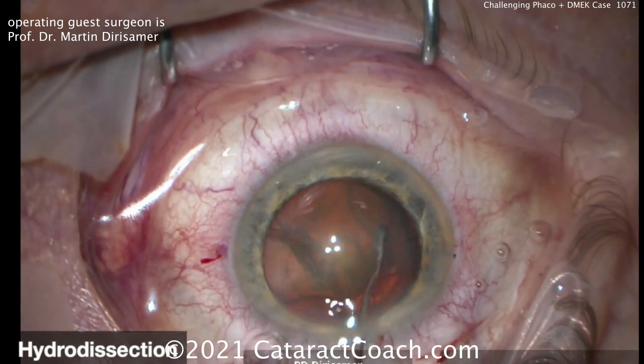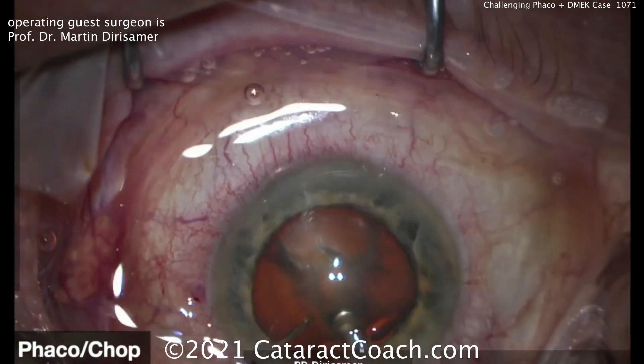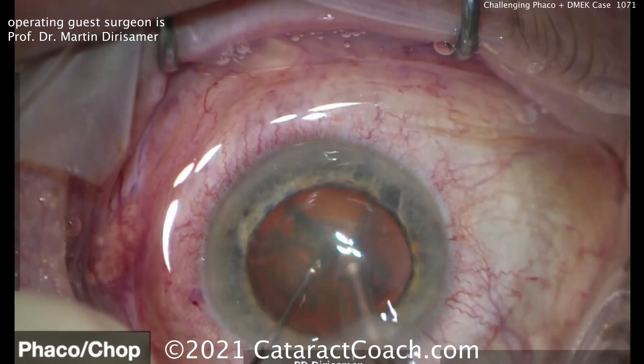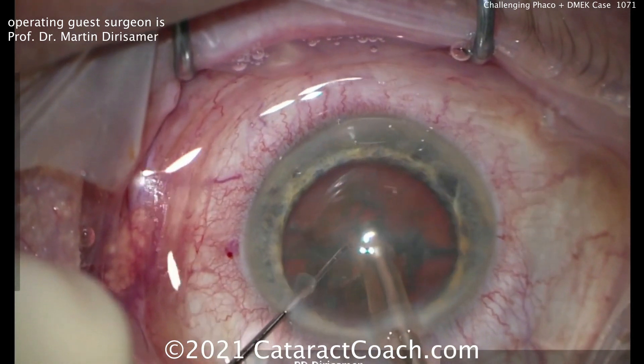A little light hydrodissection going on here, and the nucleus removal is going to be using the CHOP technique. All advanced surgeons are using the CHOP technique — something you definitely want to learn. He just has a little chop here, splits the nucleus in half, rotates it again, and breaks it into smaller fragments. That's the easy part.